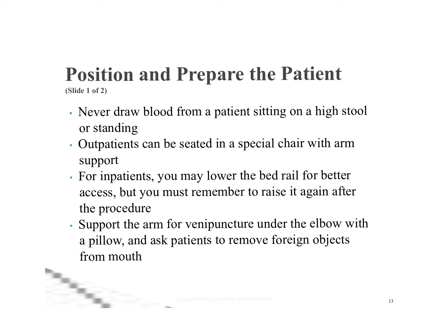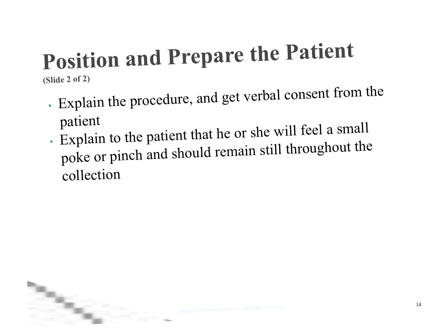We need to support the arm for venipuncture under the elbow with a pillow. Ask the patient to remove foreign objects from their mouth. And we want to make sure we explain the procedure and get verbal consent from the patient.